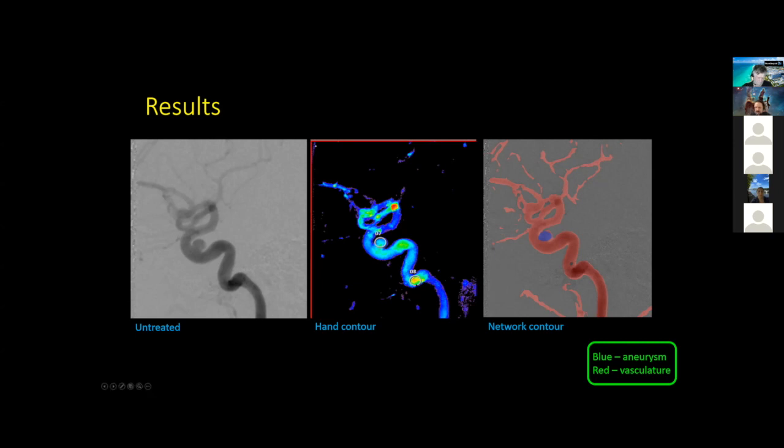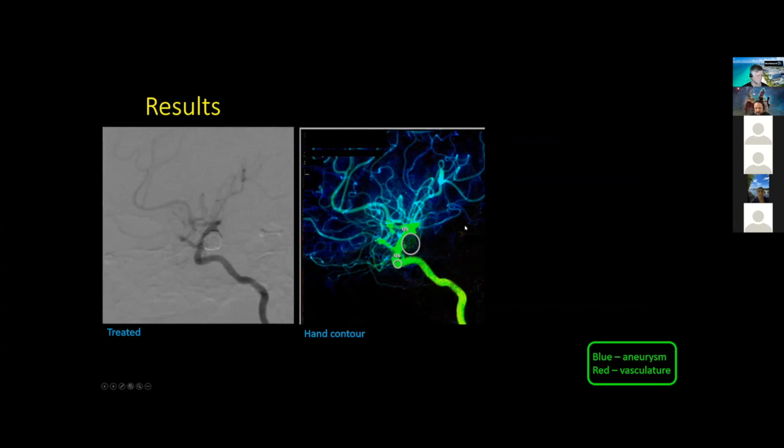And as you see, this is done. We don't need this to be done with AI. We can do this automatically just by image analysis. So I will focus only onto the aneurysms. And you see here how the AI has done a pretty good job at the aneurysm, but the distal part onto the arteries, it's so-so. So in general, it's good agreement between this.